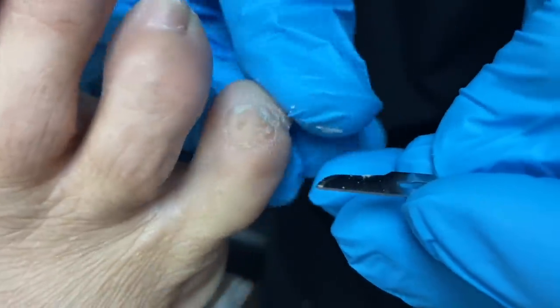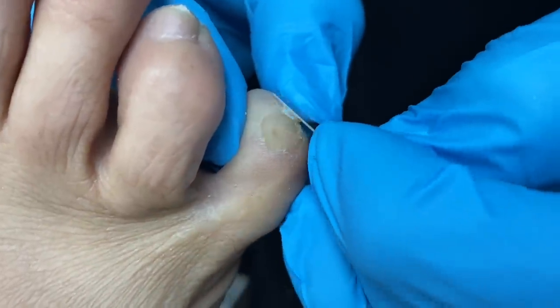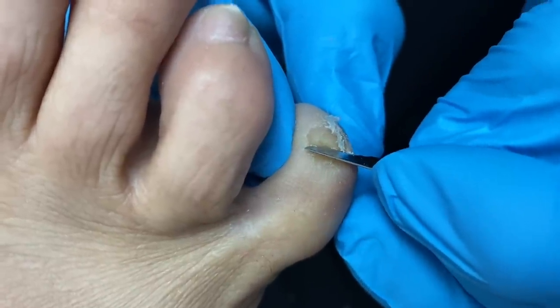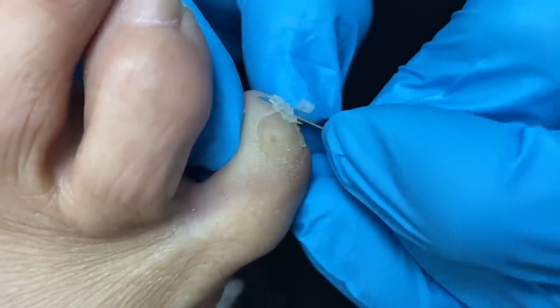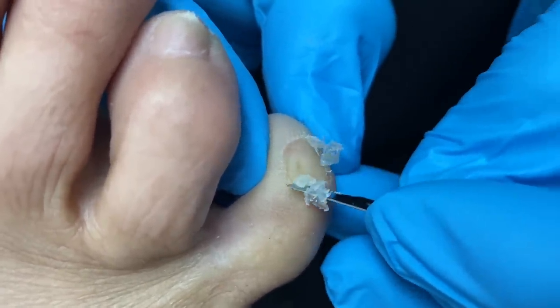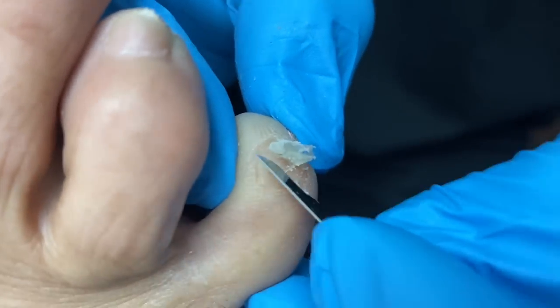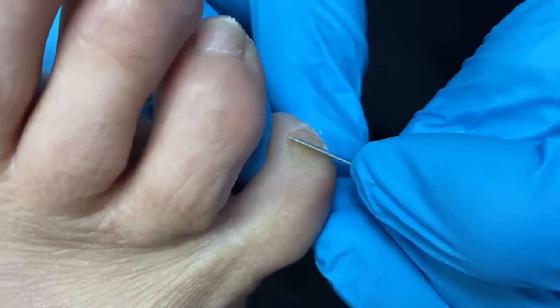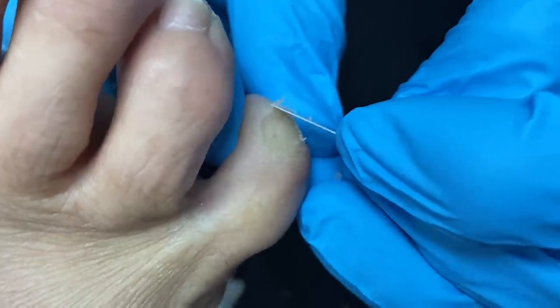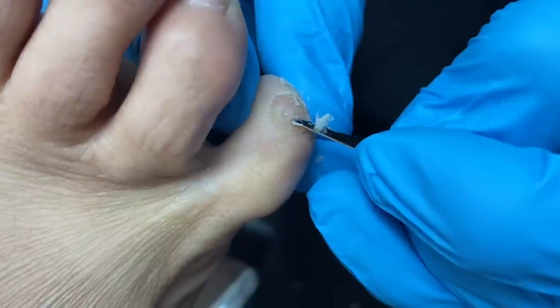You can clearly see the core right here. You okay, patient? It's a little uncomfortable, right? Every time I press down, it hurts — it reproduces the pain. It's not so much in the periphery; it's right here at the core.